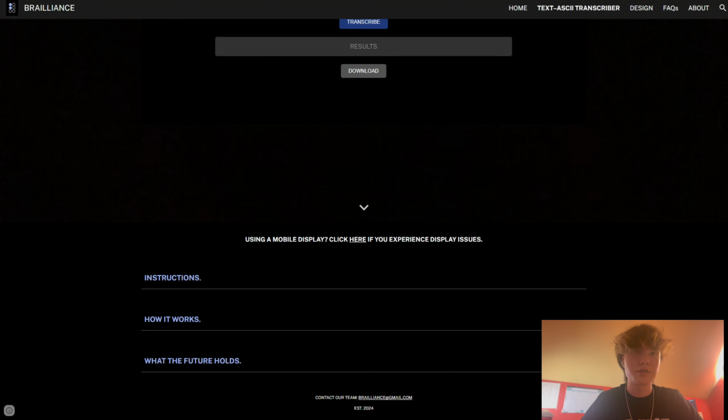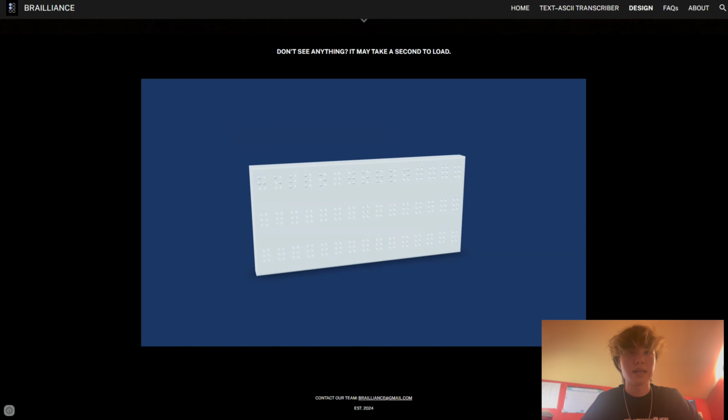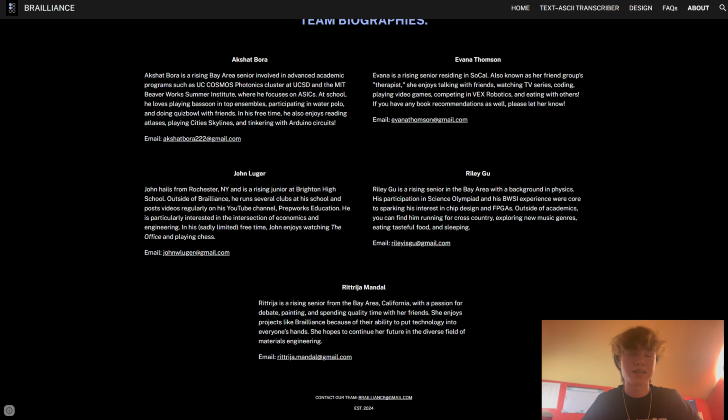Below the computer-based transcriber, we've got a simplified mobile option and some more details. The website also includes an interactive CAD display of our physical reader. Now, if you've got more questions, just check out our FAQs, and if you want to learn more about us, you can check out our biographies on this last page. And here's Riley to explain the ASIC itself.